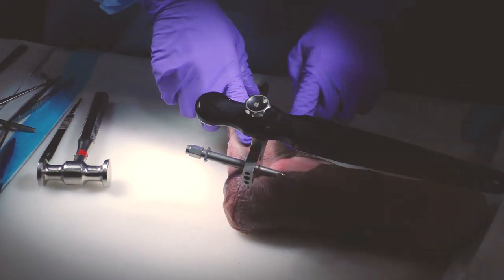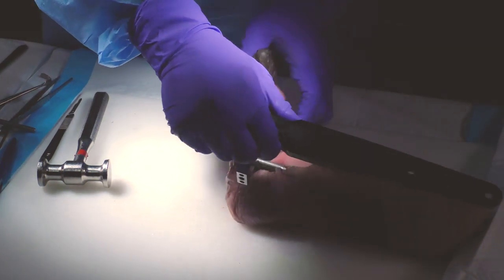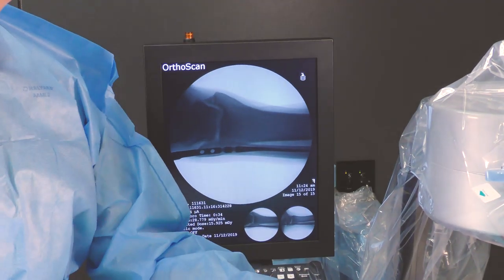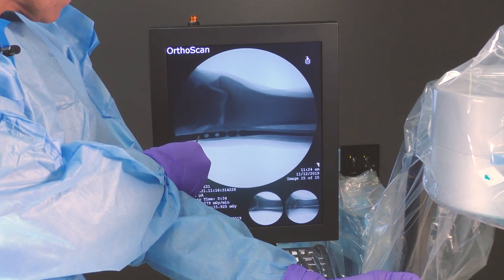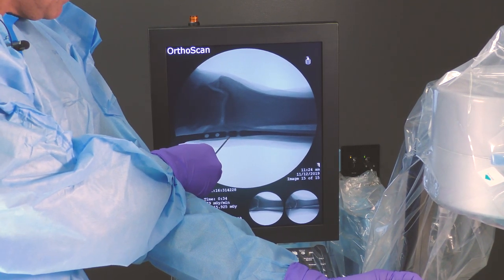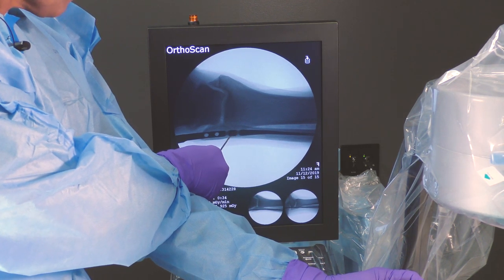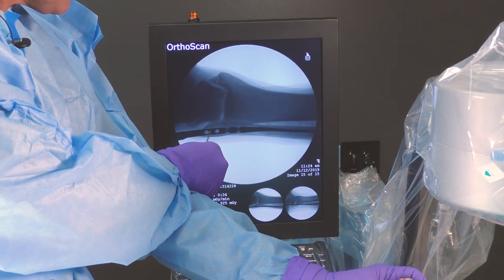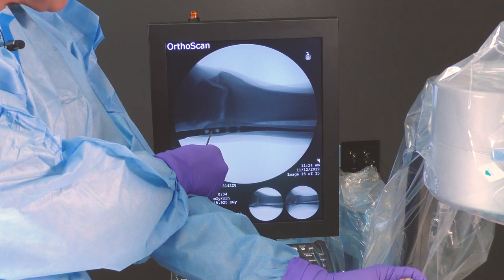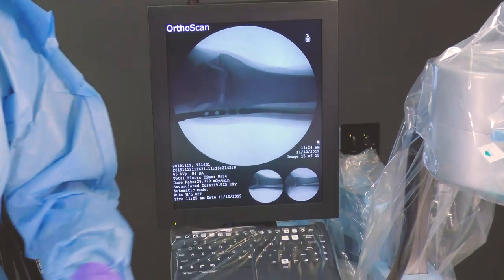It's not easy to see just looking at the skin if you are deep enough, so you need to double check that you are inside. You can see in the X-rays that the nail is almost completely in, and you have the proximal locking screws in a situation where you can use one or maybe both. These two distal ones are actually inside the fibula, so this is OK. We can still make it a little bit deeper, which is actually what I'm going to do.